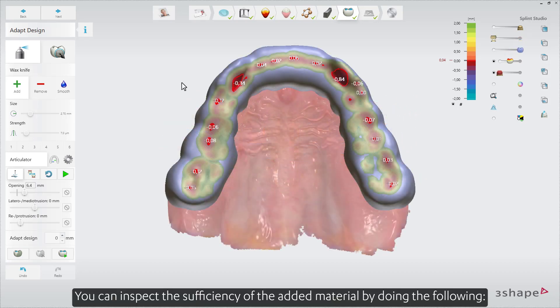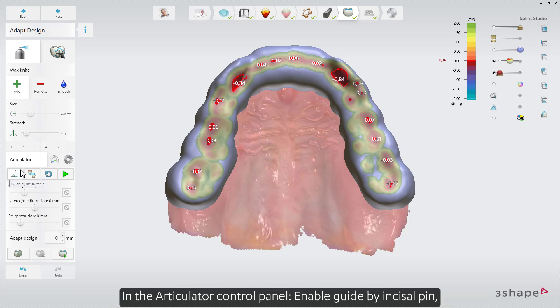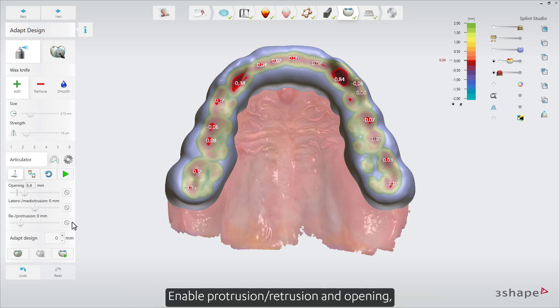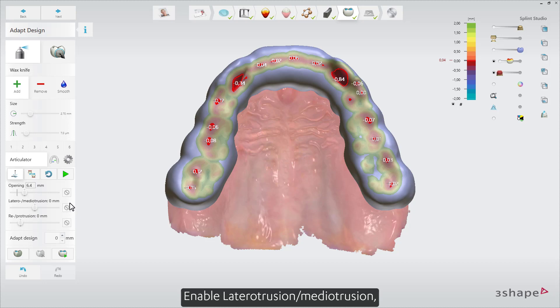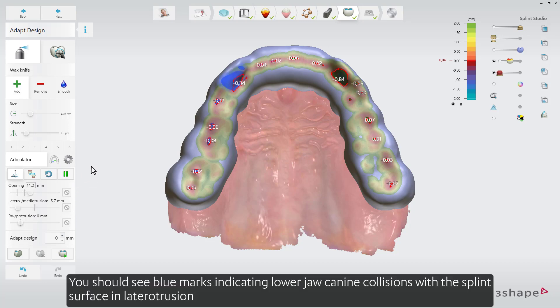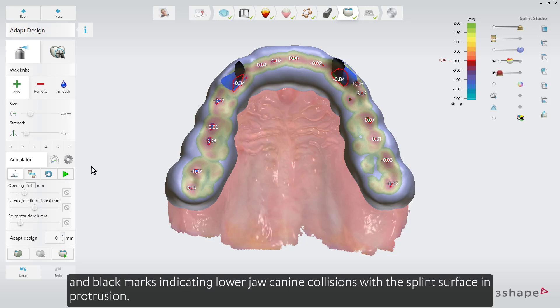You can inspect the sufficiency of the added material by doing the following. In the Articulator control panel, enable guide by incisal pin, enable protrusion, retrusion, and opening, enable lateral protrusion and mediotrusion, and run articulation. You should see blue marks indicating lower jaw canine collisions with the splint surface in lateral protrusion, and black marks indicating lower jaw canine collisions with the splint surface in protrusion.